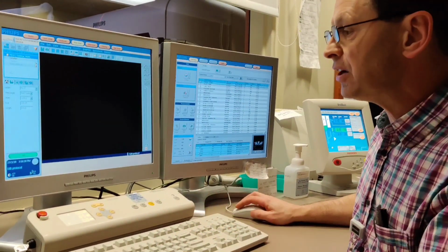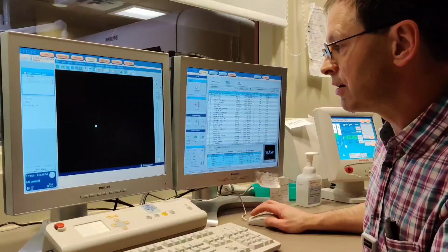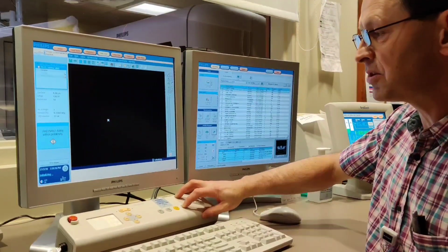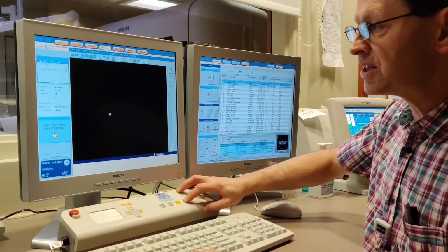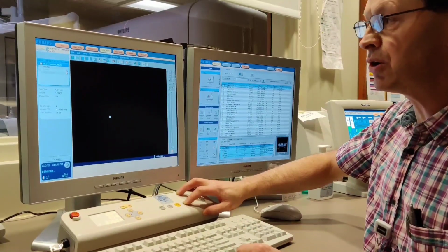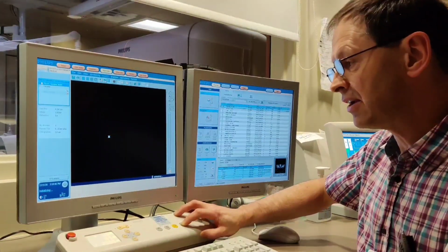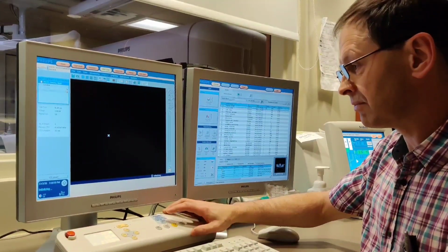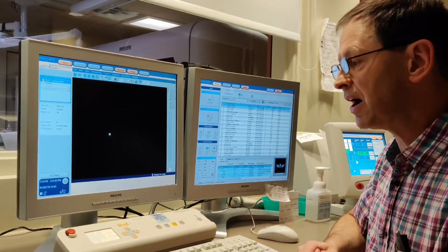So at this point, we're ready to go with the pilot. So I'm selecting go. Moving the bed into position. Once we're done this portion of the scan and we've done our test injection, we'll go through some of the other steps, the locator tracker and the actual scan, and what each of those mean. Head with the scan, the pilot scan.